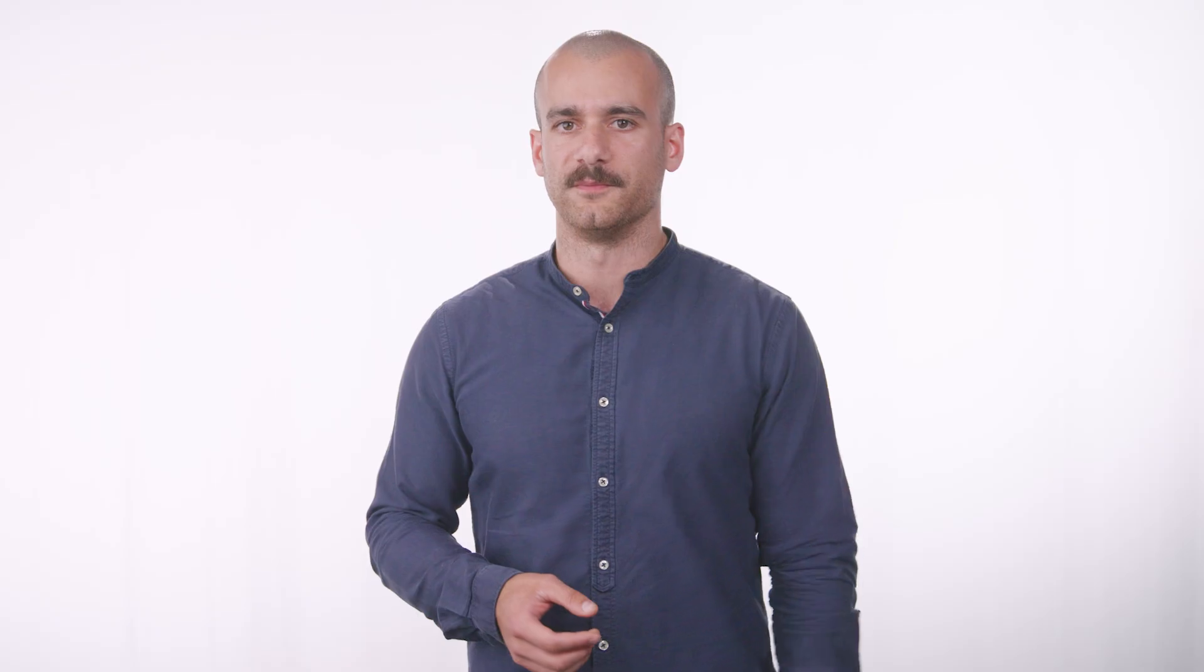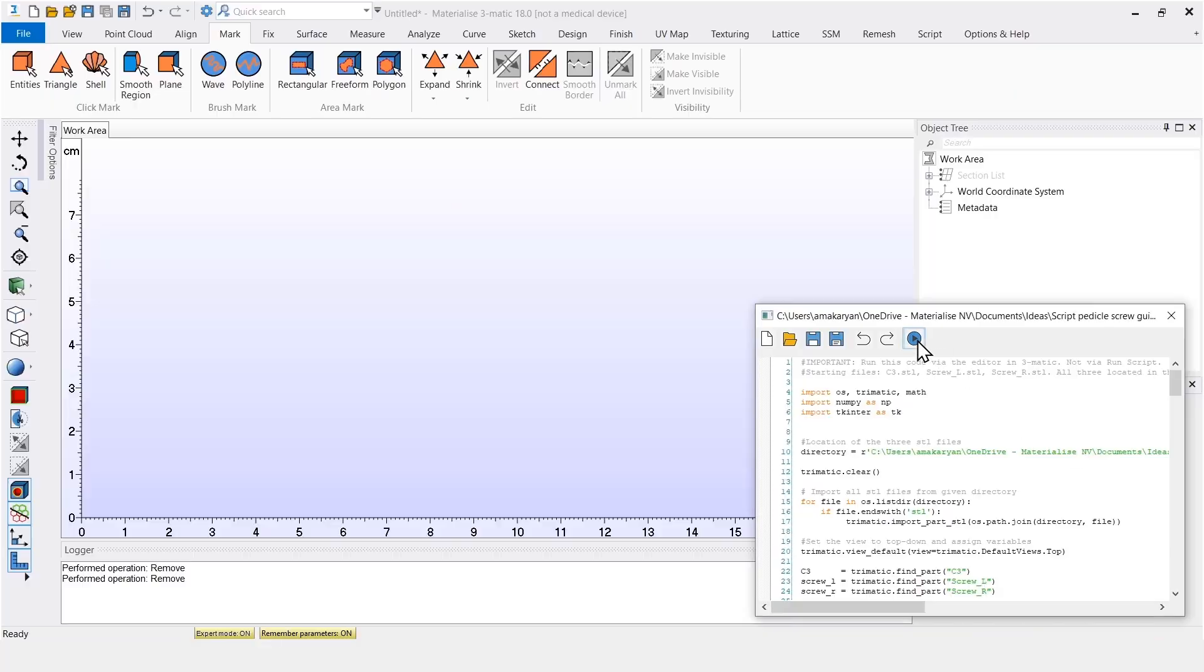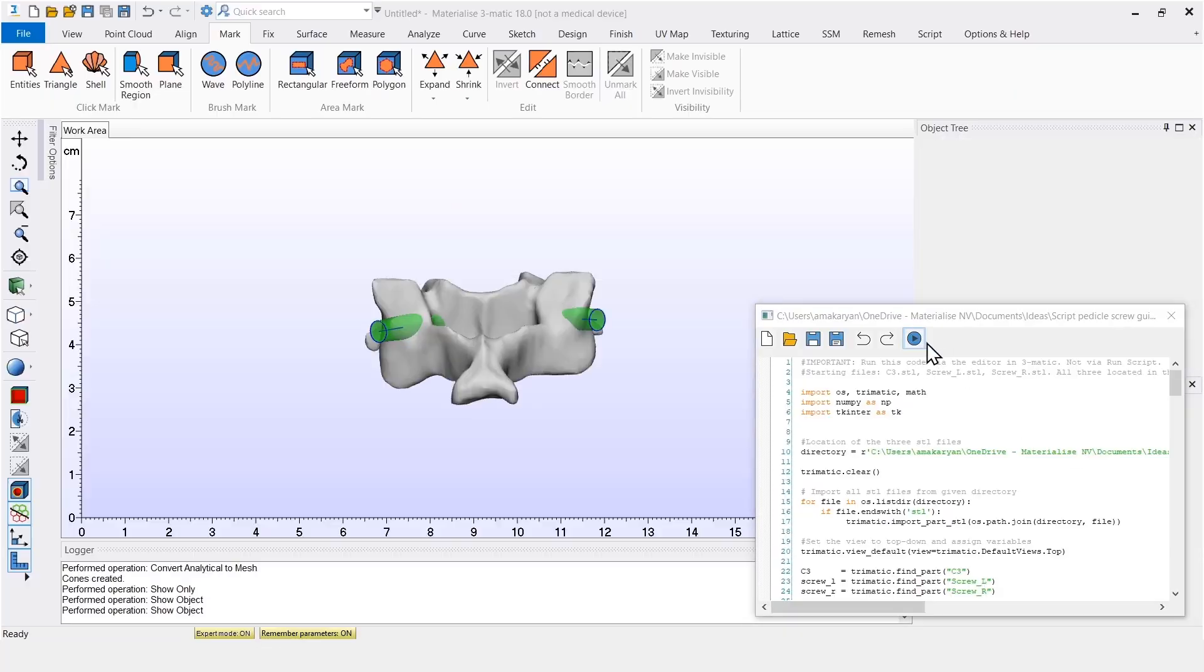Now, I'll show you the automated version of the same workflow. I'll first run the script, and then I'll quickly go over some of the code with you. So if I start with an empty 3matic file and run the script, all the necessary STL files are imported automatically.